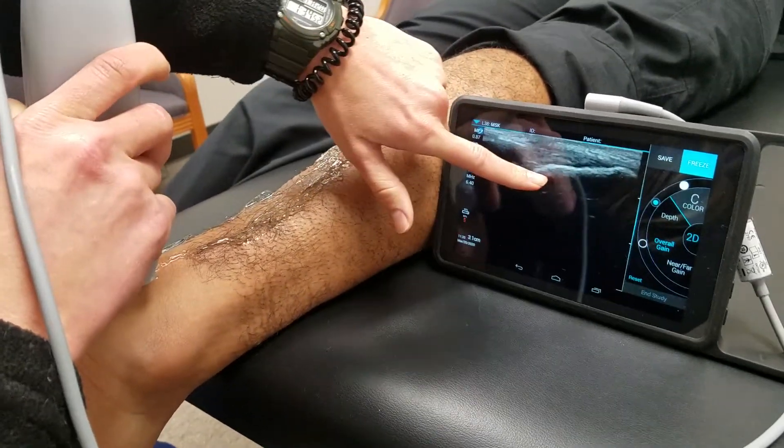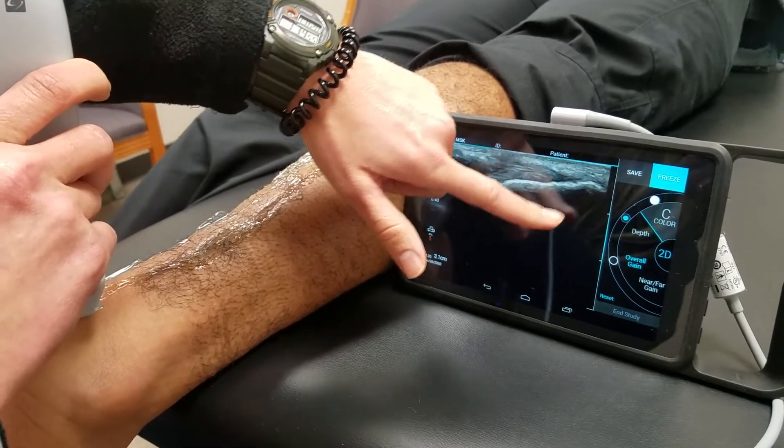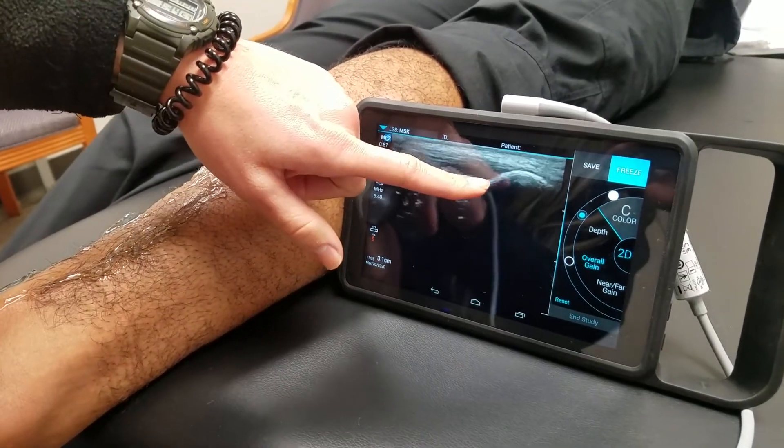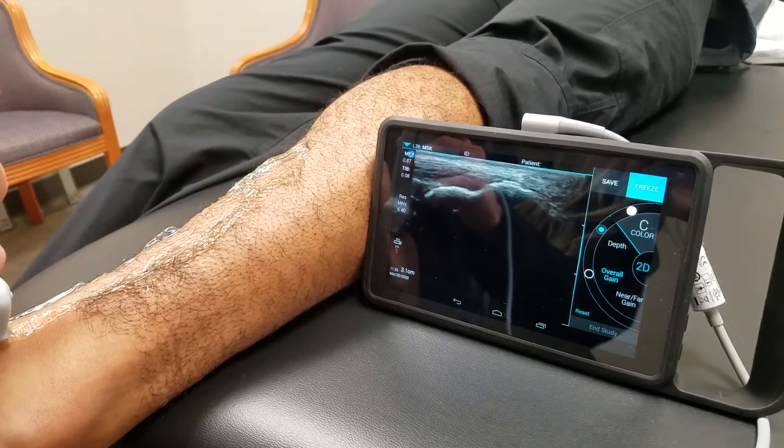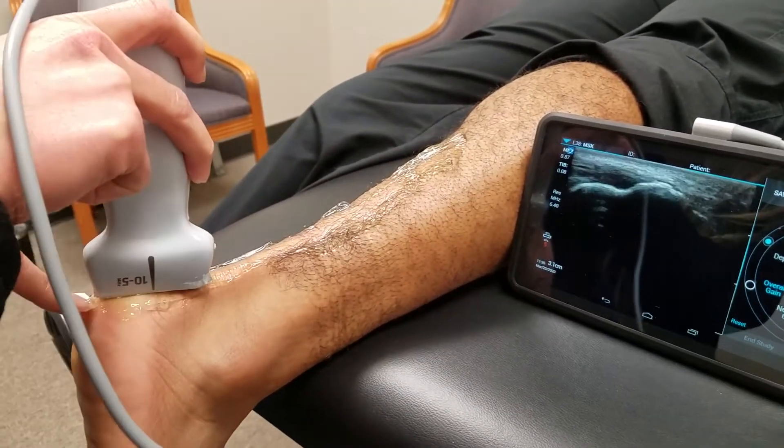You can see the calcaneus — that's the bone right there — the really bright line, and the darkness, that's the bone. Your Achilles tendon attaches right here to the top of your heel, right in there.